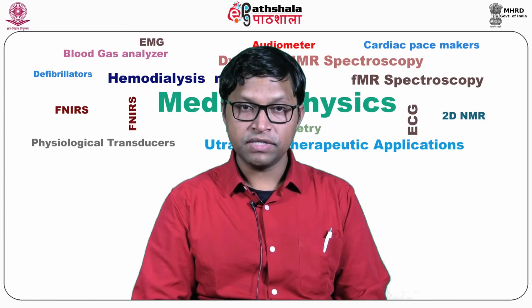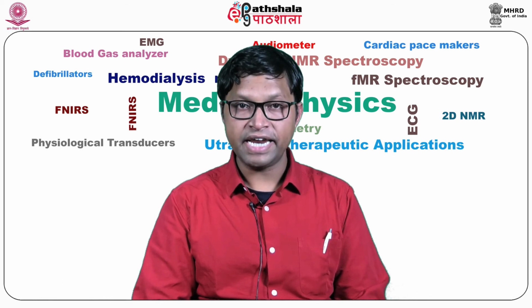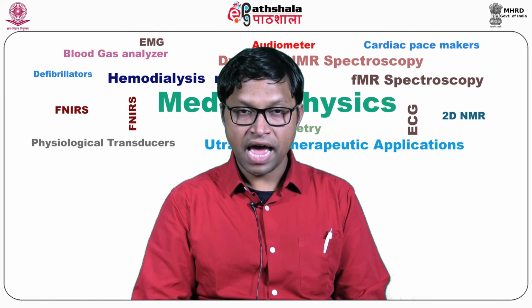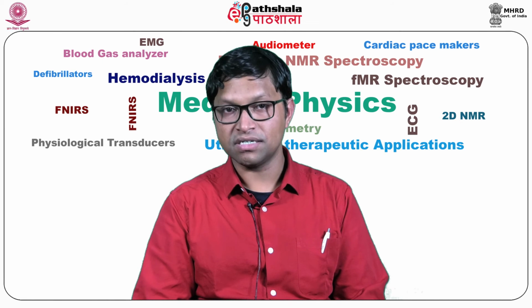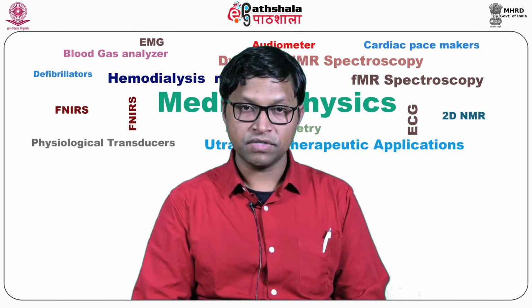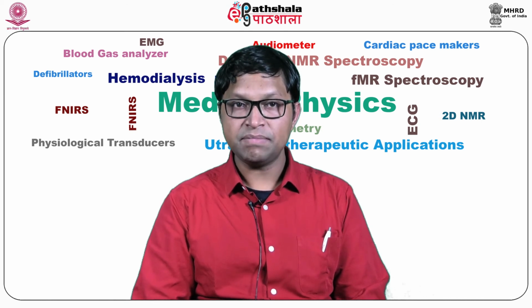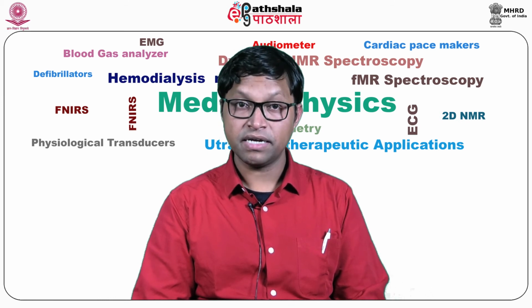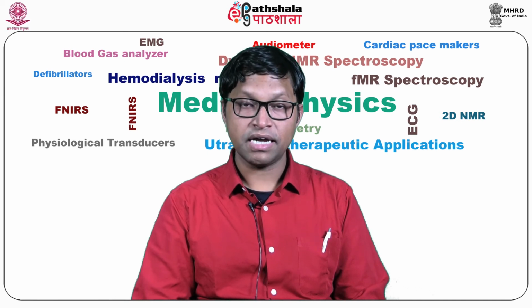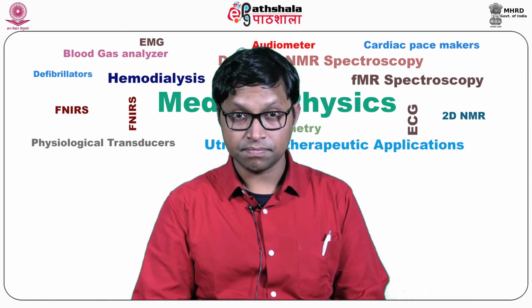The next component of the EMG machine or the instrument is the amplifier. It is a high gain amplifier which has a selectivity for frequencies from 10 to 5000 Hertz. The third component of this system is the recording system. In any design of an EMG signal acquisition system, the three principal requirements must be kept in mind. The front end interfaces the analog input signal to the analog to digital converter system.